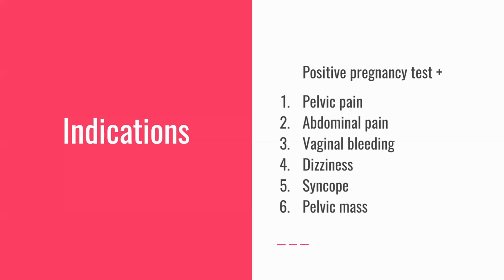Are you just going to ultrasound everybody who's in their first trimester? Probably not. But if you have a positive pregnancy test and any one of these type of symptoms or signs or complaints, then I think it's a good idea to go ahead and try that ultrasound. Pelvic pain, any abdominal pain, vaginal bleeding, any sort of dizziness or syncope, and any sort of pelvic mass.